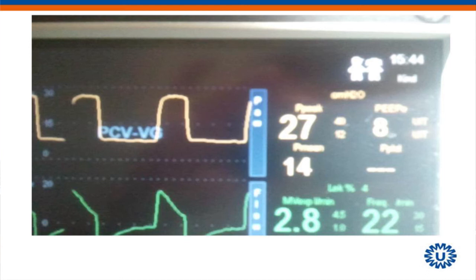Can you see this, or should we put the lights out? No? Sorry for my shaky hands. They are made with my mobile. So.